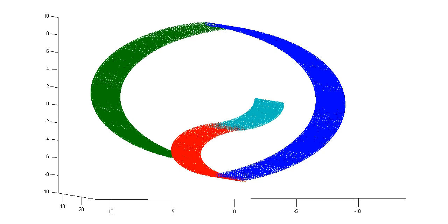Now people try to correct for motion artifacts. They try to infer that a person was moving by looking at where their skull is and where their brain is. But these methods are a bit imperfect. And then also when people do analyze the data, they often add blurring to it as well. So there's lots of complexity in terms of artifacts that can be introduced and blurring.